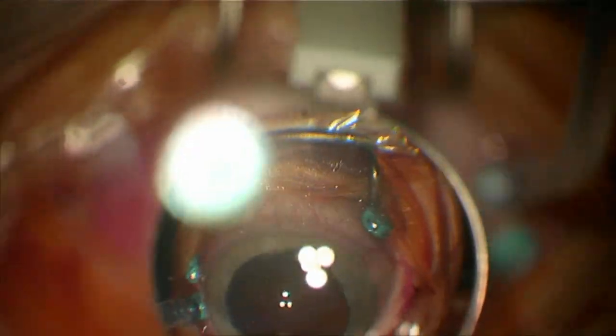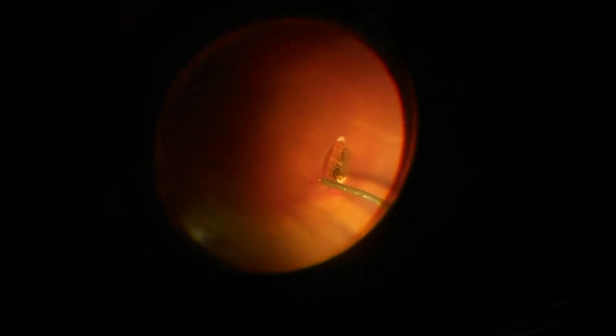Today we will discuss a case of retinal detachment in a myopic patient with a relatively posterior vitreous base and a fairly large eye. Here you can see the tear in the superior temporal quadrant, which is also quite posterior, located within a small lattice degeneration. Since there was some bleeding, we quickly performed a coagulation of the bleeding vessels, which also helps mark the tear to ensure it remains visible during surgery in case we encounter difficulties.